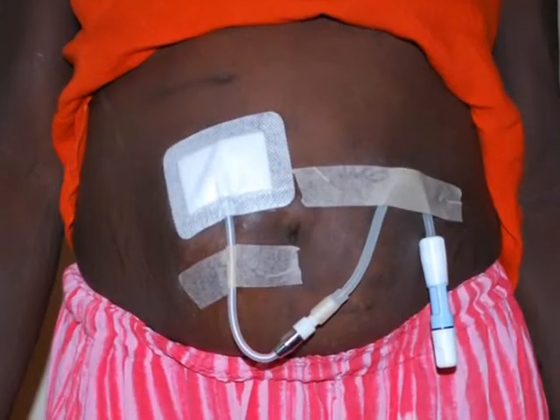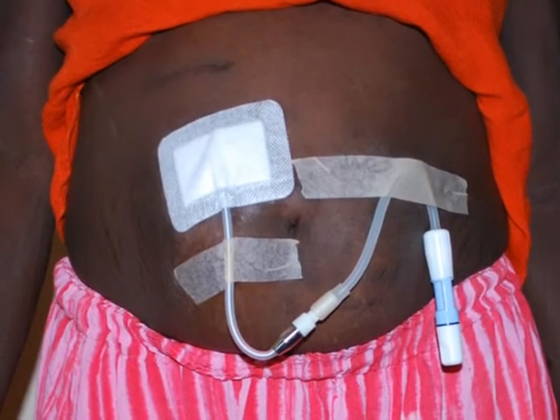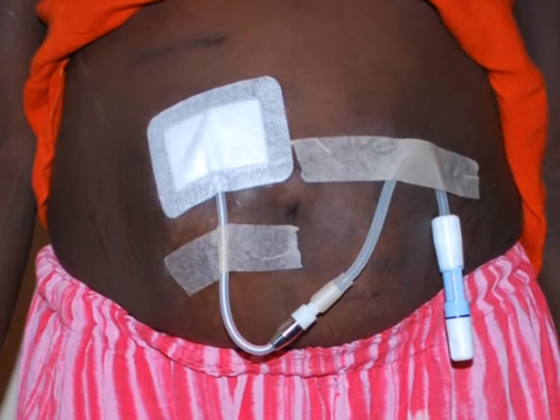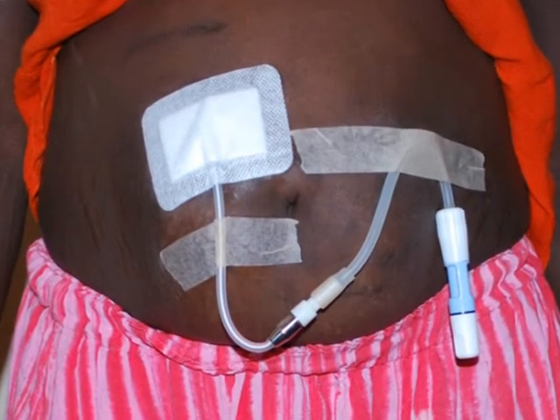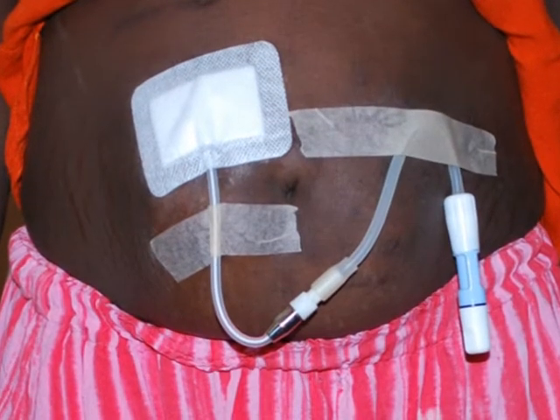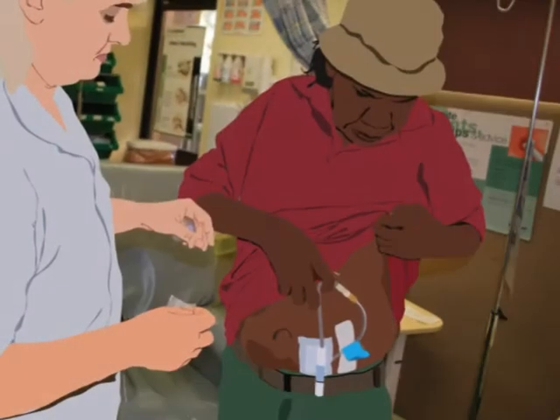You should be very careful about keeping your catheter clean. That catheter is a small hole to the inside of your body. If germs get in there, you can get very sick and it can be dangerous. The nurses will show you the best way to take care of your catheter.